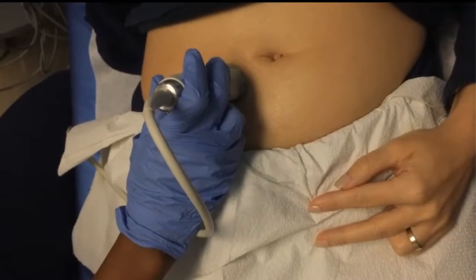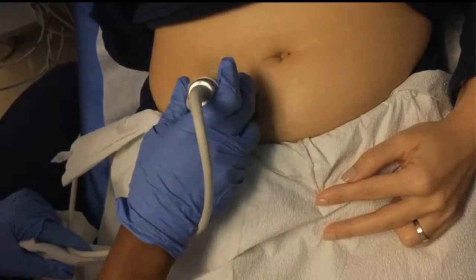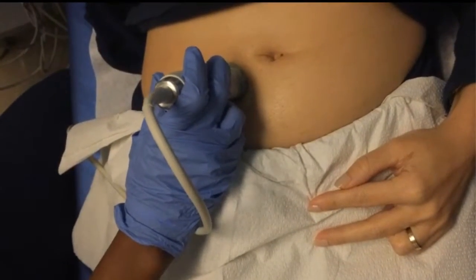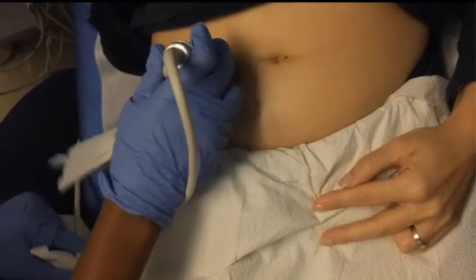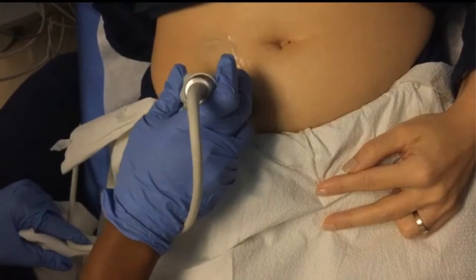Compressions with the transducer should be performed to help displace small bowel loops out of the way. The displacement of the bowel should allow the visualization of the iliac vessels in the right iliac fossa as well as the psoas muscle. Compressions will help determine if appendicitis is present or not.